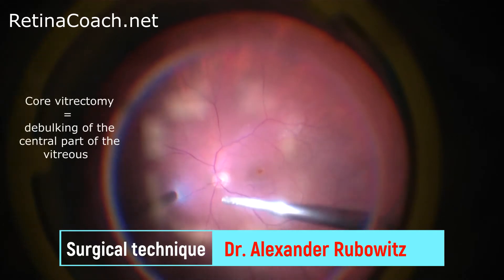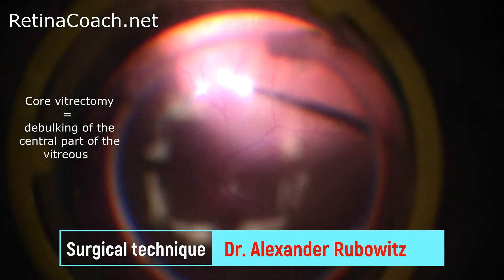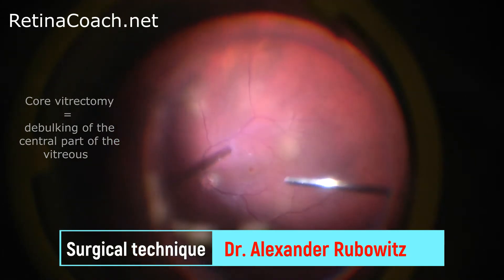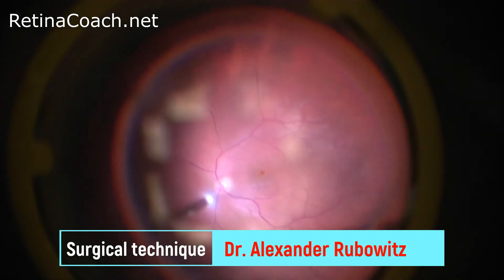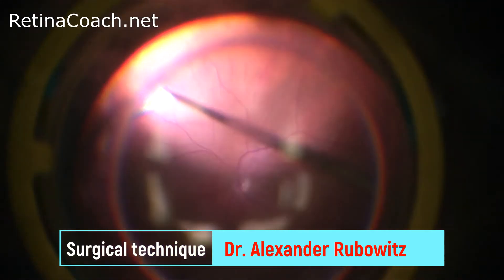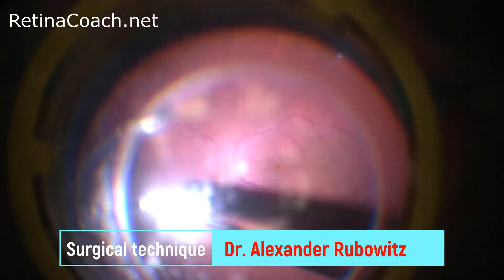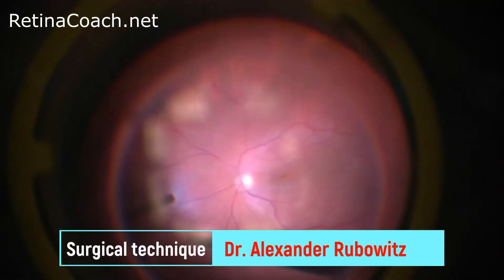Debulking of the central vitreous allows further manipulations in the vitreous cavity during surgery without traction on vitreous strands. It also allows approach to the pre-retinal space — for example, for injection of triamcinolone to stain the posterior hyaloid, or injection of dyes for membrane staining.